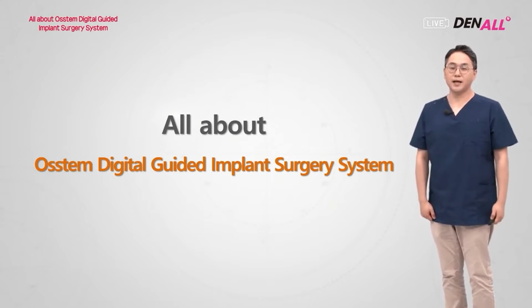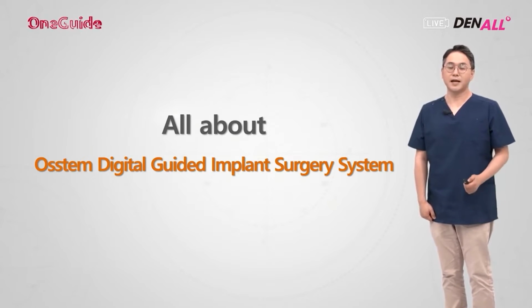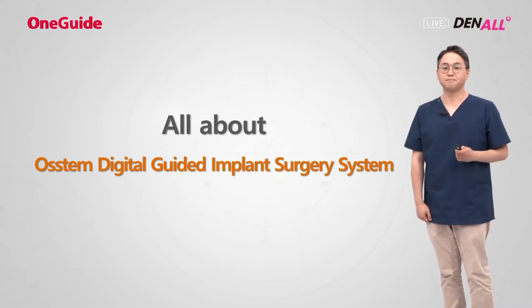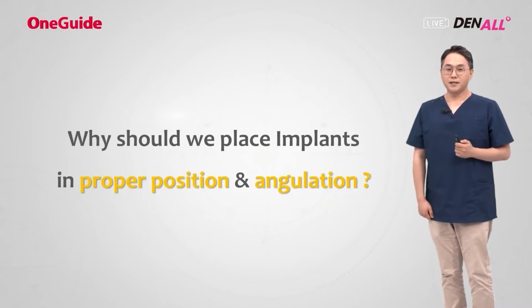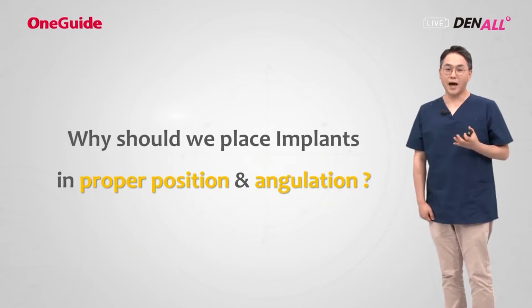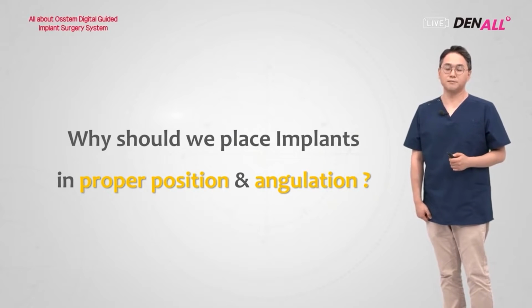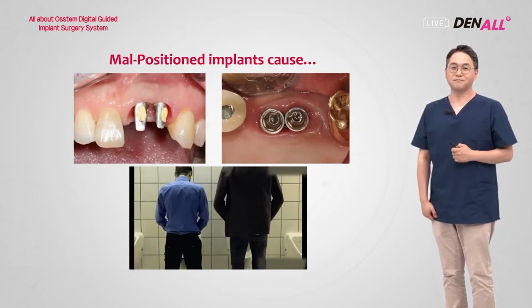First, you need to have an understanding of digital guide surgery to use OneGuide. So in the first lecture, I'm going to talk about digital guide implant surgery. This is the introduction. We talk about placing implants well. What does this mean? A well-placed implant is an implant placed at the center of the prosthesis. This is a well-placed implant. How about this?